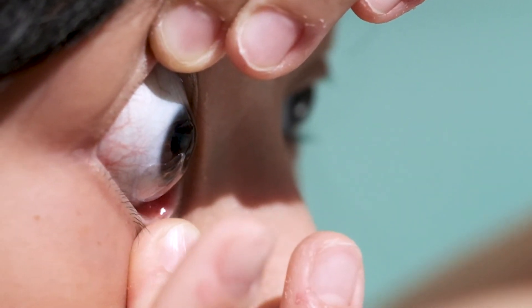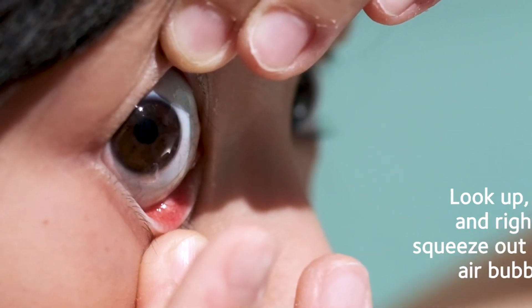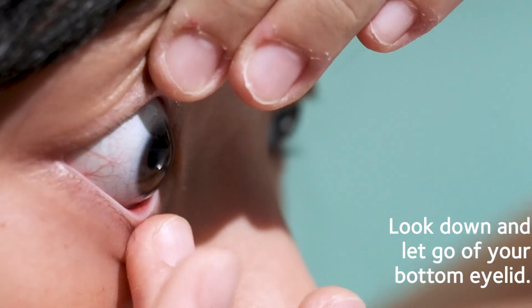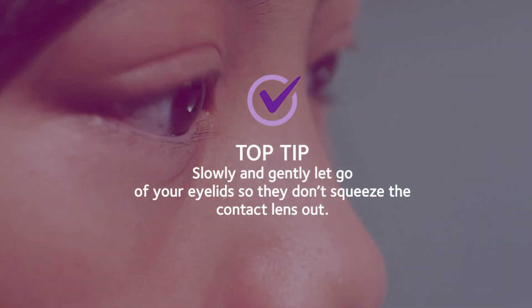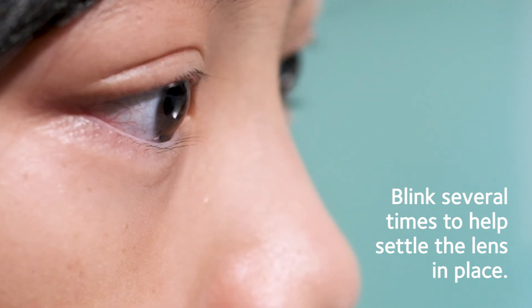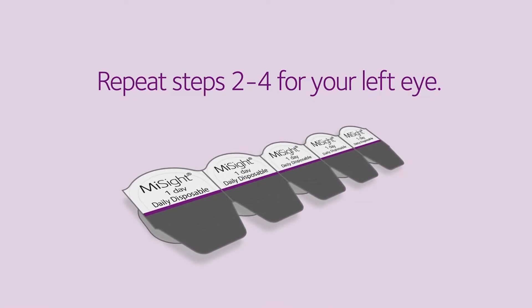Once you feel the lens on your eye, very slowly move your index finger away but keep a hold of your eyelids. Look up, left, and right to squeeze out any air bubbles. Look down and slowly let go of your bottom eyelid, then look straight ahead and slowly let go of your top eyelid — gently, so they don't squeeze the contact lens out before it's had a chance to settle. Now blink several times to help settle the lens in place, and repeat these steps for your left eye.